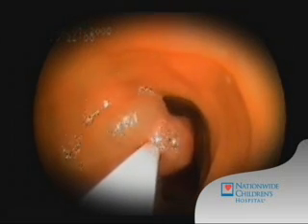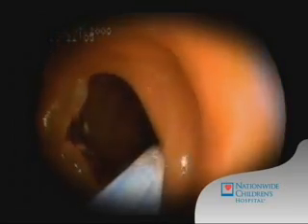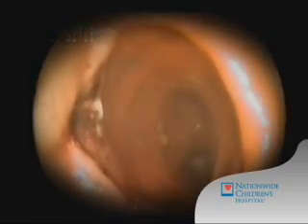Higher frequency current is then passed through the wire, which then literally cauterizes or vaporizes the tissue, cutting the polyp from the wall, as seen here. This leaves a clean, sealed base where the polyp used to be.